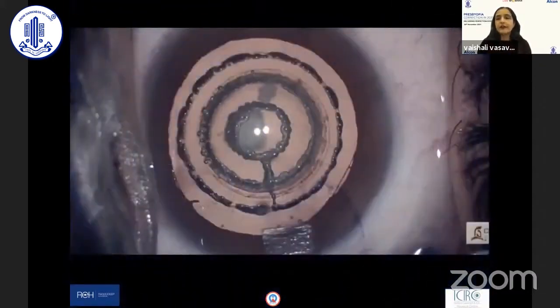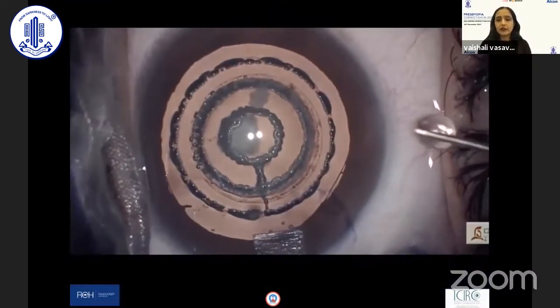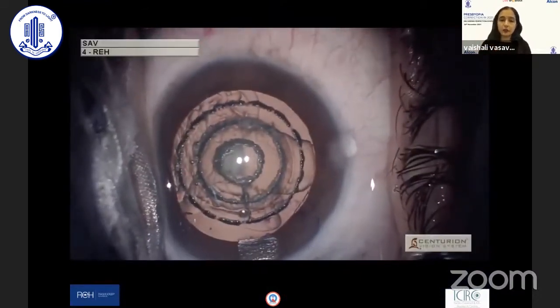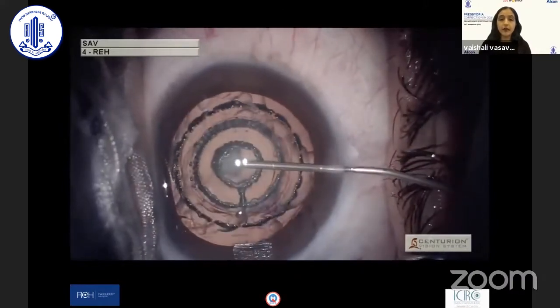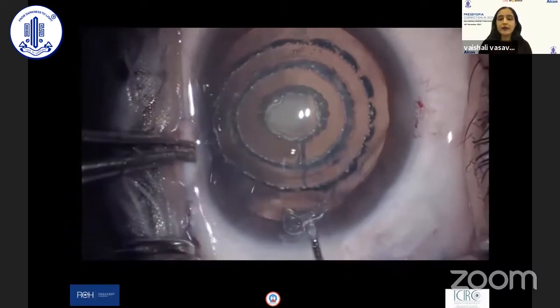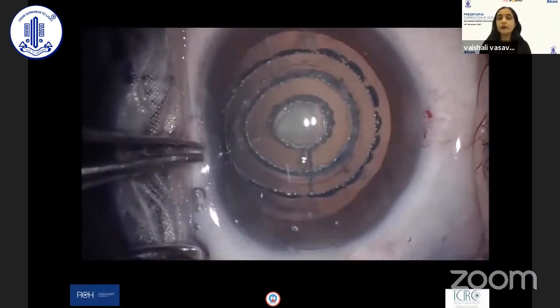So here we find the technique of femto delineation, which is basically creating these cylinders with the femtosecond laser, very, very useful. Also, you get a very good sized and centric rhexis. And look at the incision. There was a lot of criticism a few years back about femtosecond incisions, but I don't think that's true, at least with the LenSx platform that we are used to. So my point again, technique and technology.